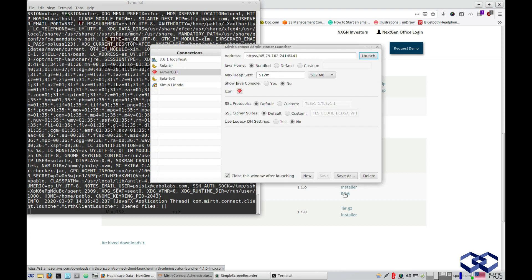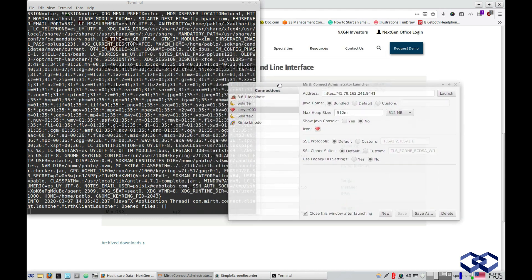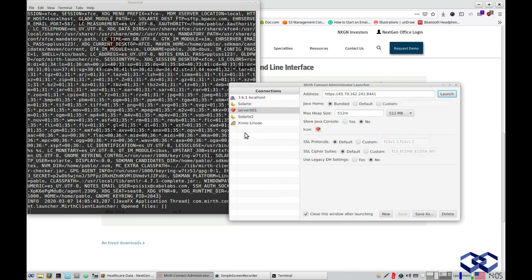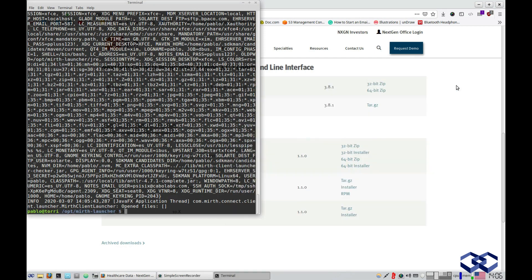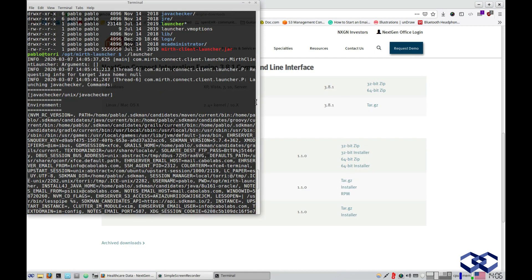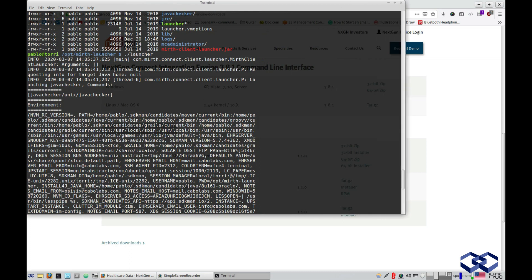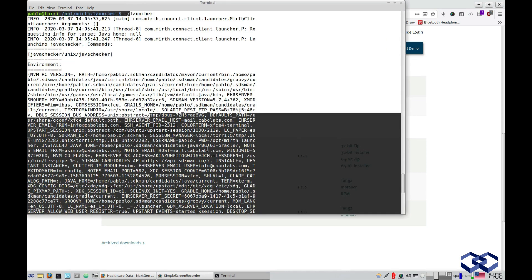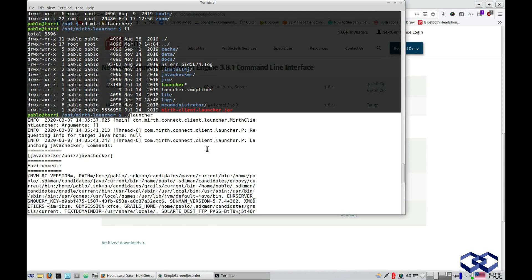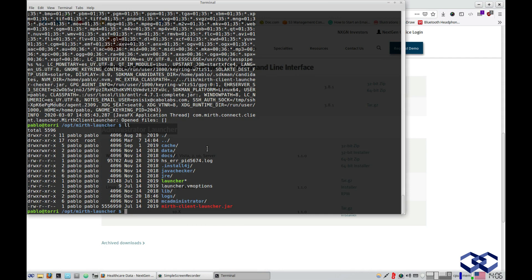So you need two things: MIRTH Connect and the MIRTH Connect Administrator Launcher. It was difficult to determine the specific version of the Administrator Launcher from the files inside it. If you don't already have the MIRTH Administrator Launcher, just download it.